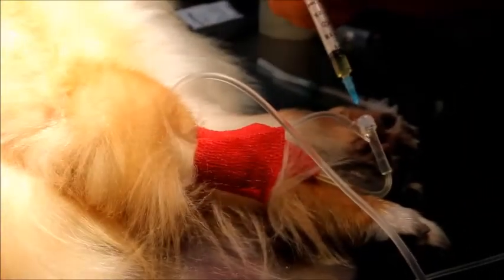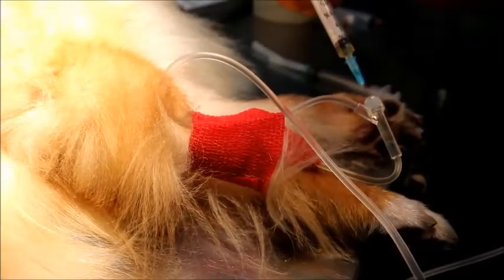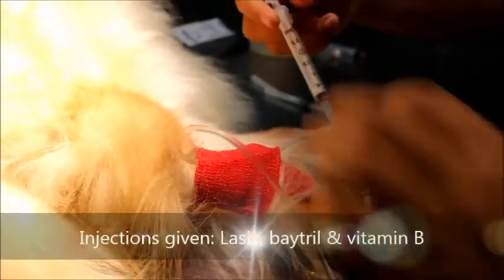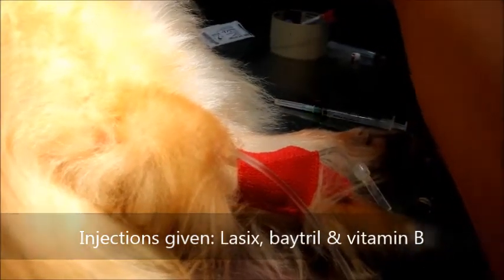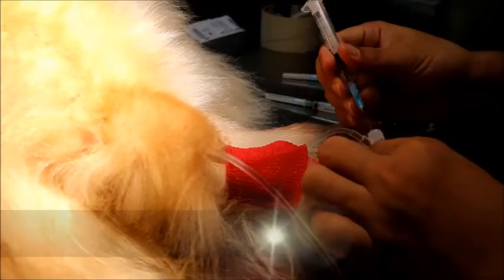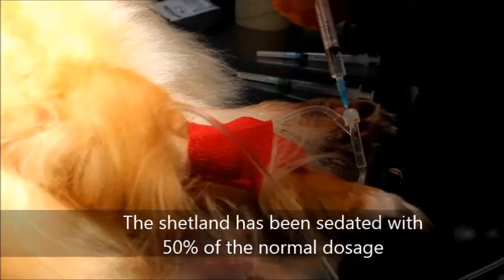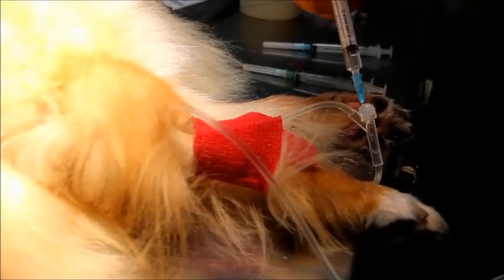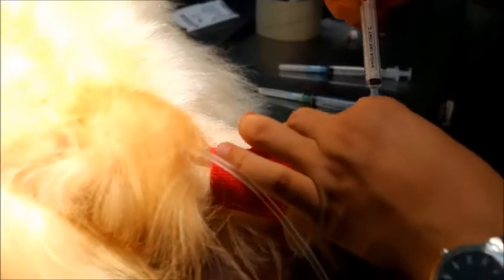Anesthesia and surgery. For this dog, a 7-year-old male Shetland, for dental scaling I gave Lasix, Baytril and vitamin B complex IV. After giving a drip, the dog has been sedated with 50% of the normal dose, and then I will put on the gas isoflurane, and then the scaling will be done. Now you can see this dog is sedated now.